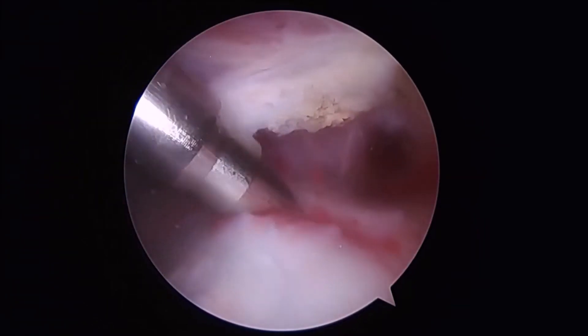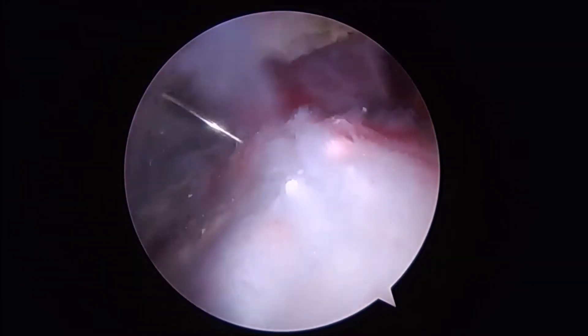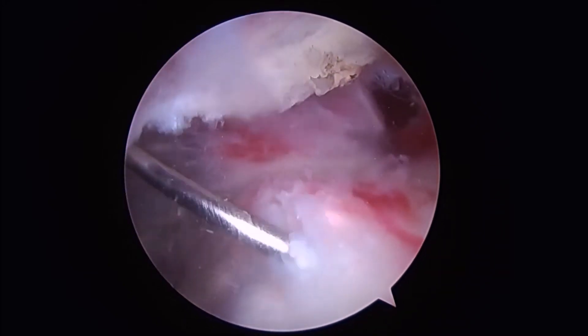The case begins with diagnostic evaluation of the subacromial space, localizing the calcific depositions within the rotator cuff. A spinal needle is used to trephonate the calcium deposits in an effort to break up some of the debris.